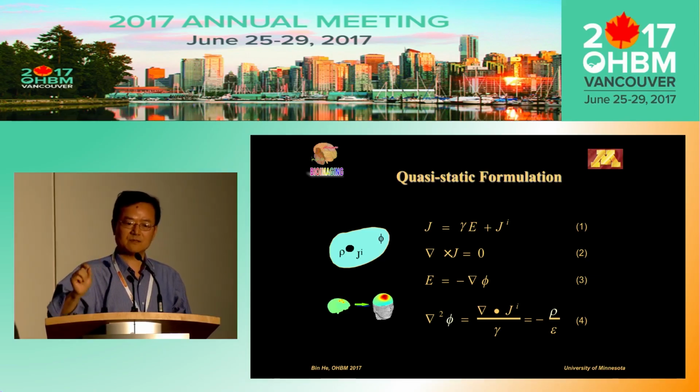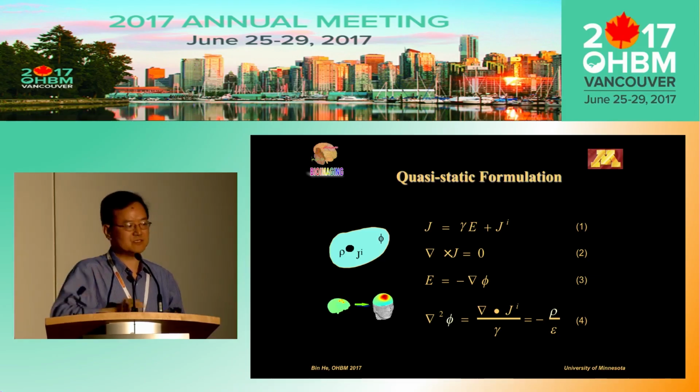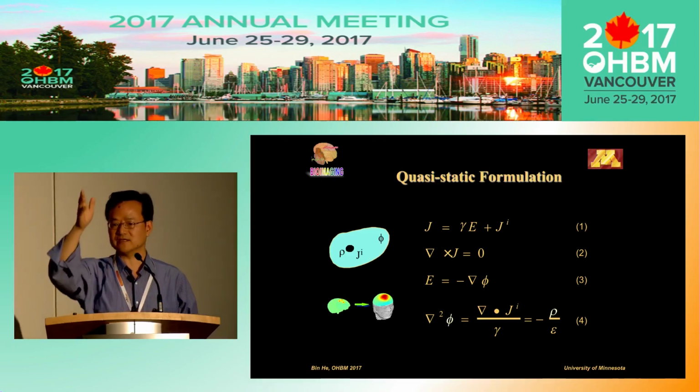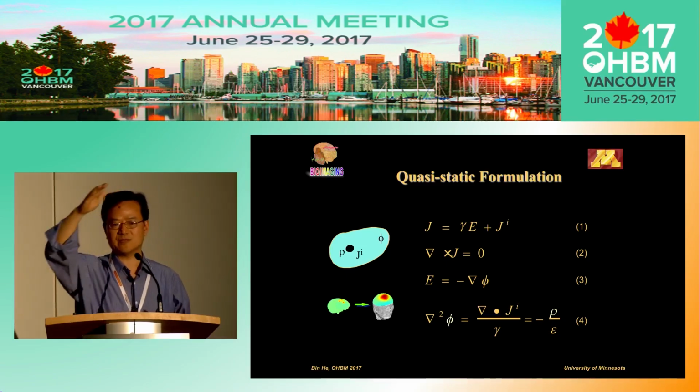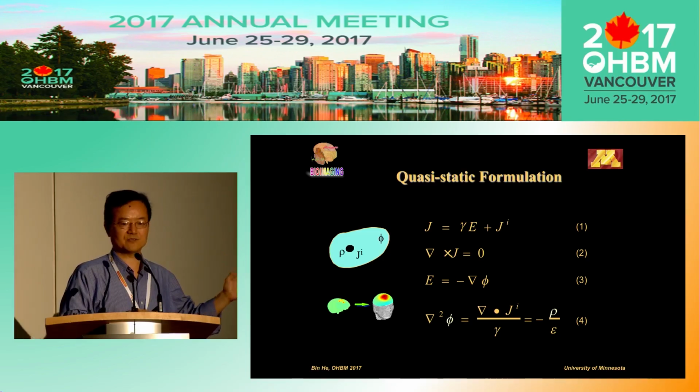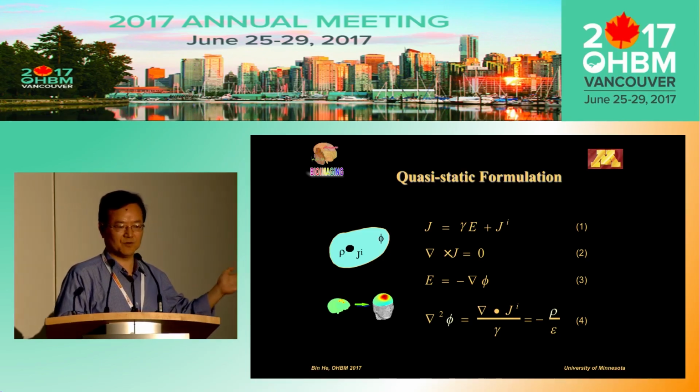That means the second spatial derivative acting upon EEG or MEG is then linearly correlated to the source term. So you can think about that the true source is very sharp and the EEG, MEG measurement is going to be smooth. So this is essentially the challenge we're facing, explained by the forward problem.